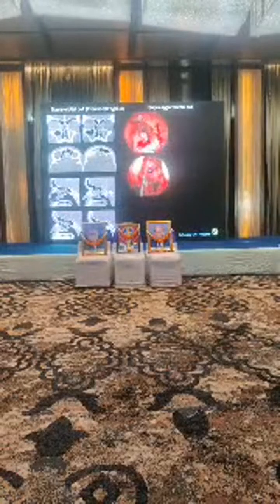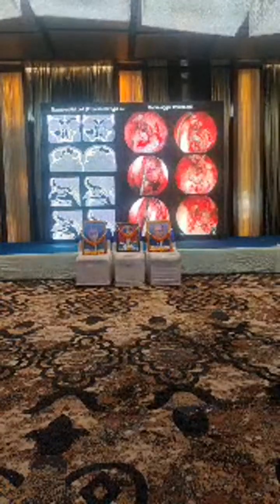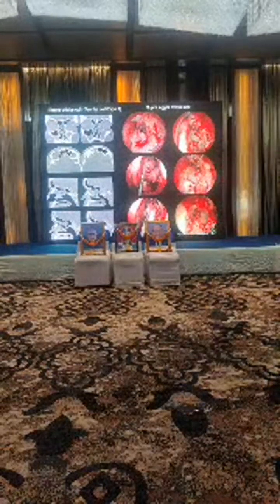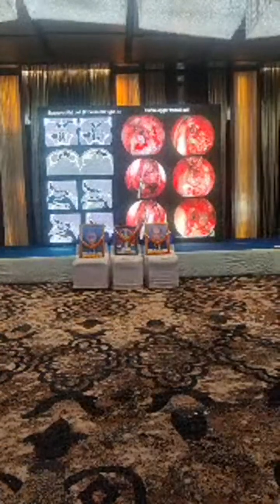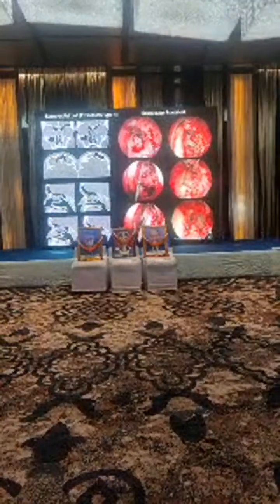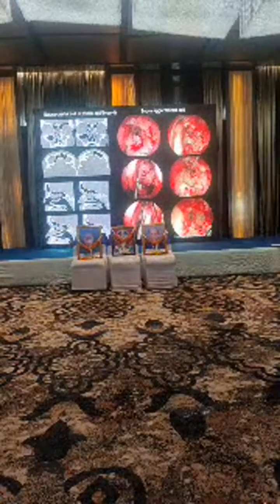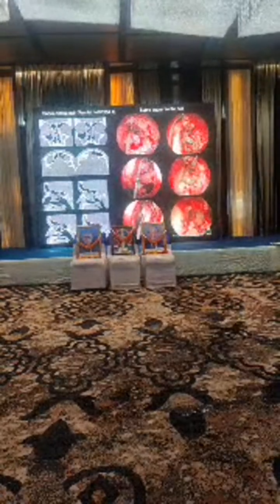This is on the right side. See, you can see there is a very small frontal sinus drainage pathway. It's a big cell over there. Even this much small frontal sinus pathway, if you don't injure the mucosa around the opening, then that will heal very well and that remains patent.